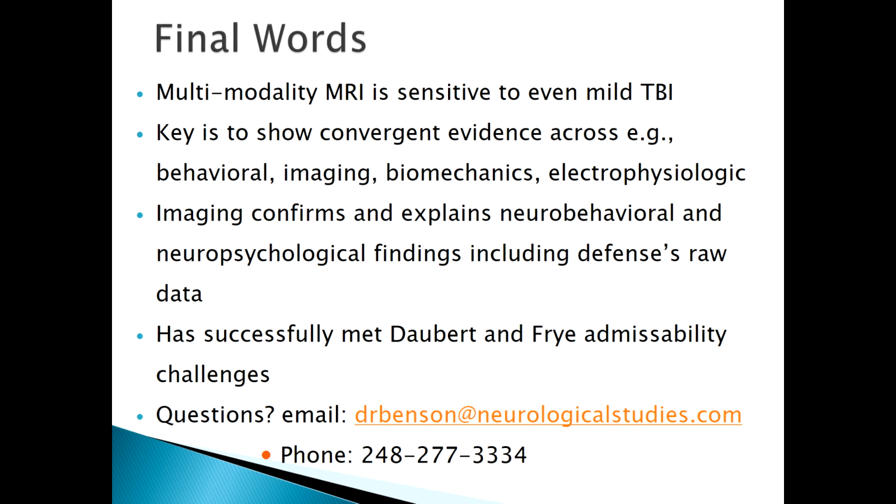Turns out FLAIR is also very useful and may be positive in as much as two thirds of cases of people with persistent symptoms. Certainly we're looking at cases where individuals come to us with persistent problems. So these are not the people who get better really quickly. So we're looking probably at a select group, but these are still mild patients.